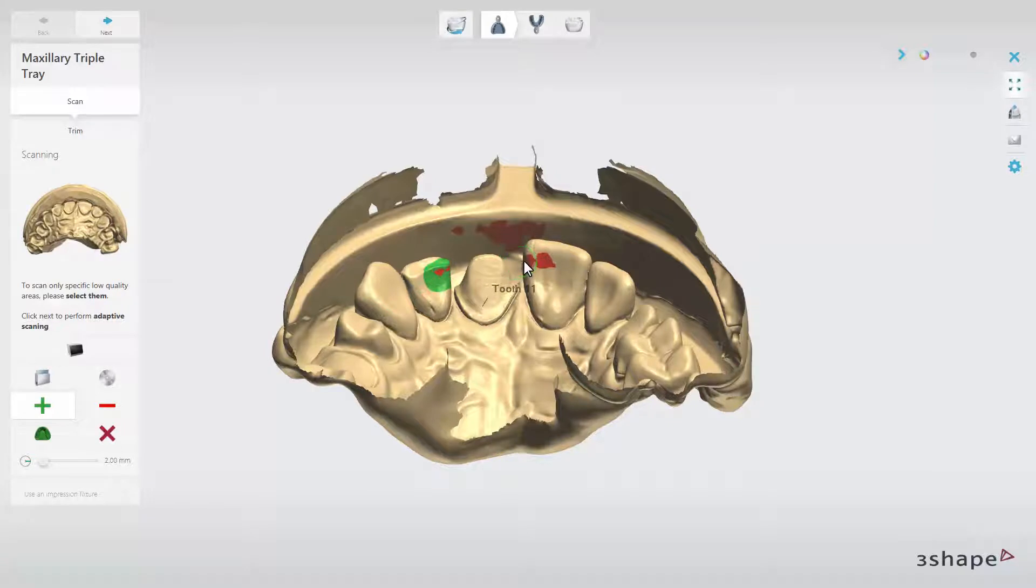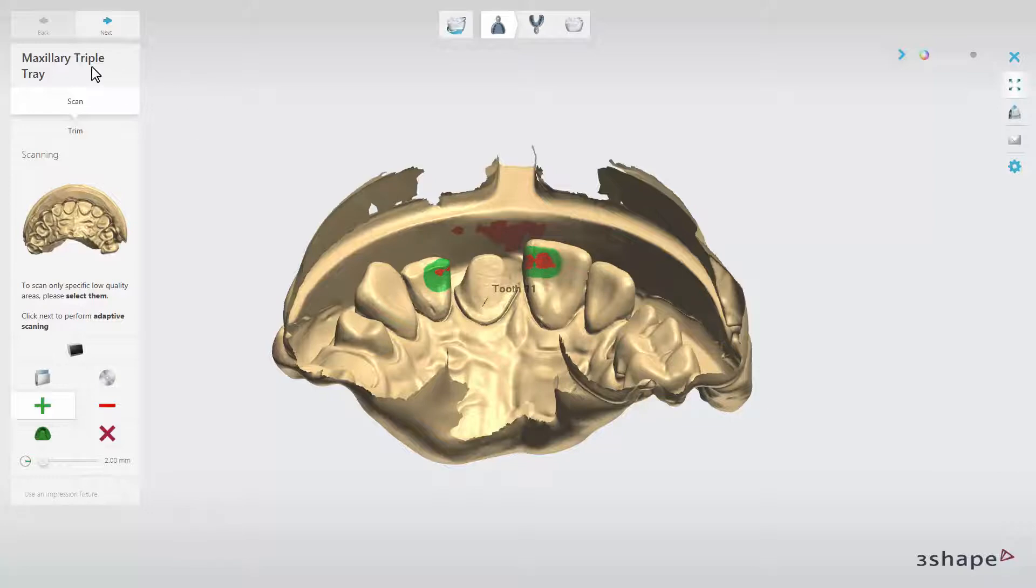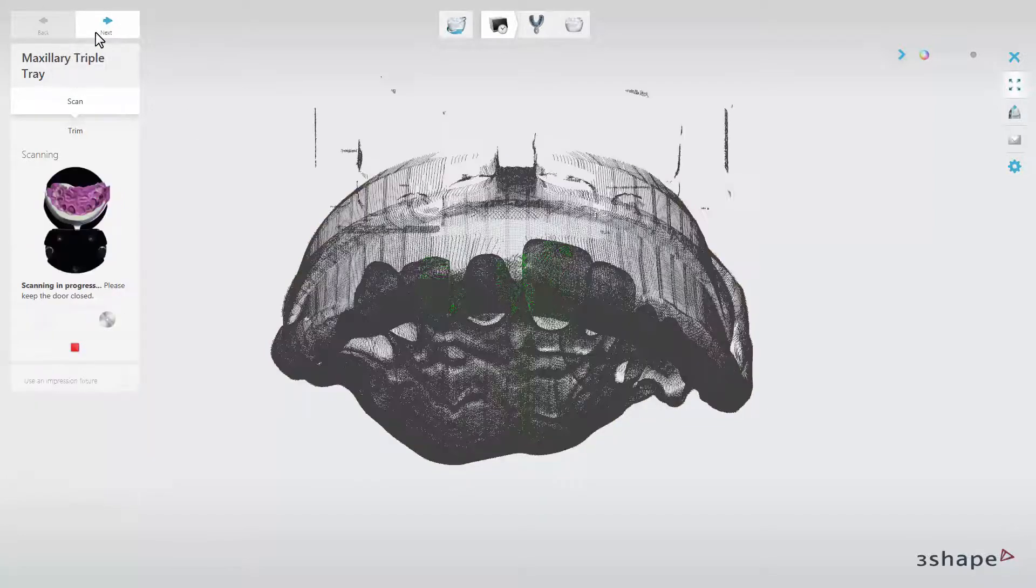It will allow you to re-scan selected areas. Just mark the parts of the scan that should be re-scanned and click Next. The scanner will re-scan it.